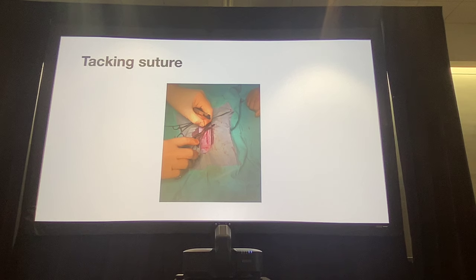You may find it to be more challenging. Some animals are crazy, though most aren't that bad. Just be aware that when you open up your linea, you put a finger on the other side of the linea, so you don't cut into small intestine or something on the underside of the body wall. But otherwise, take it for what it is.